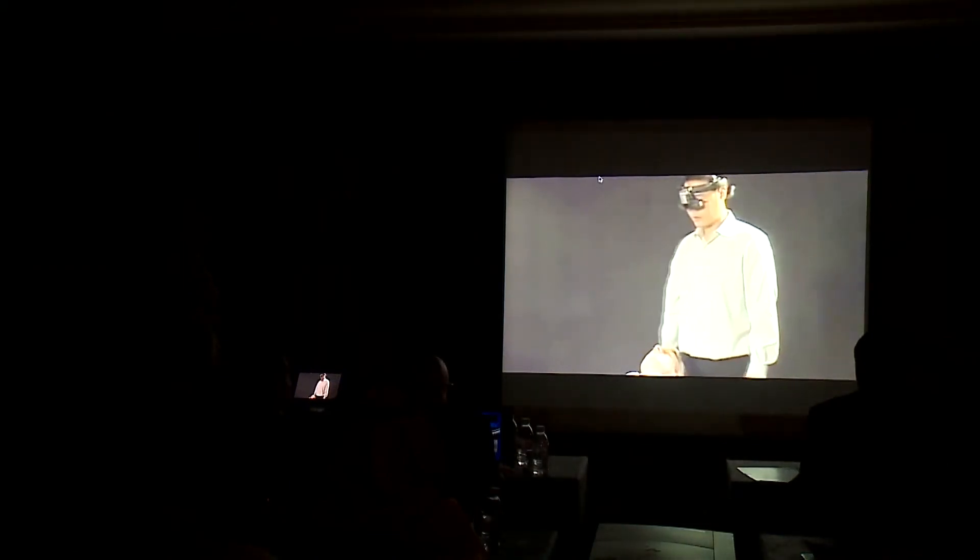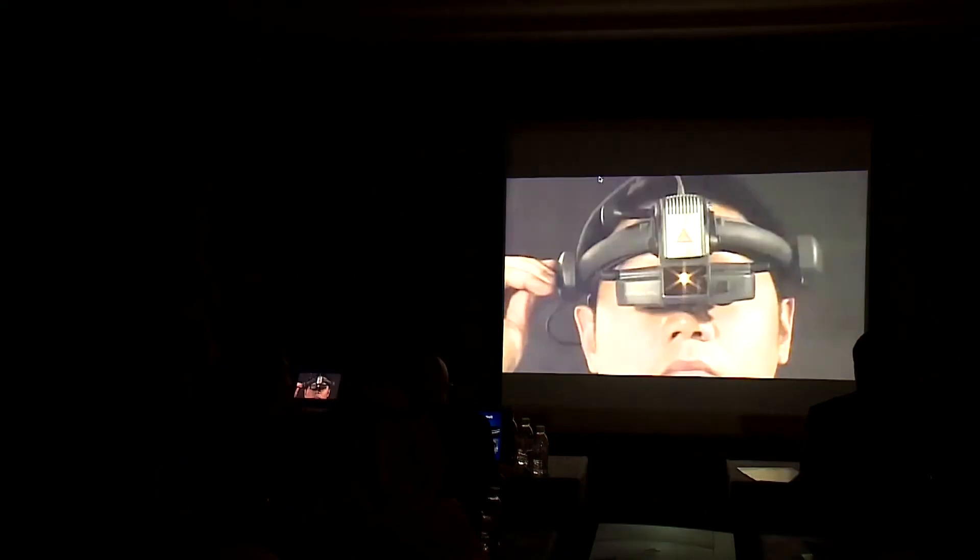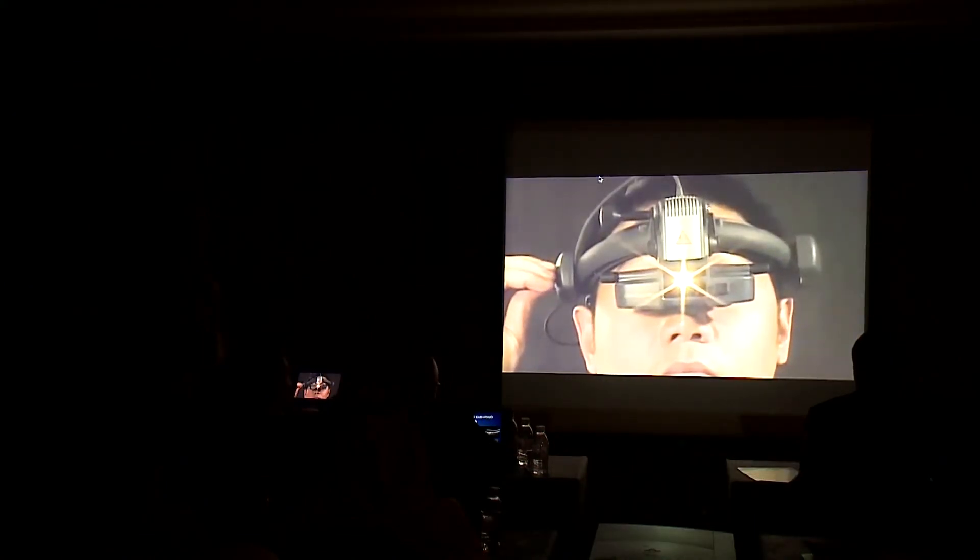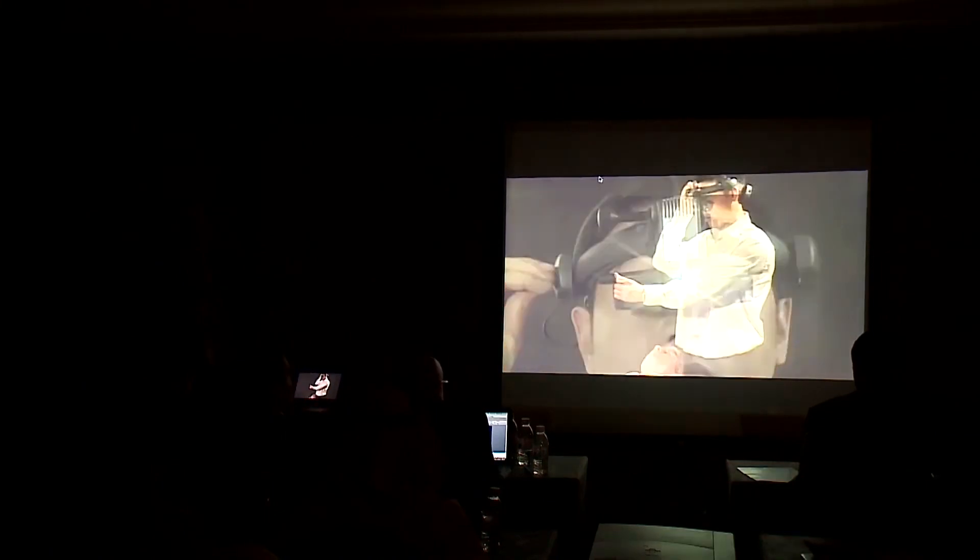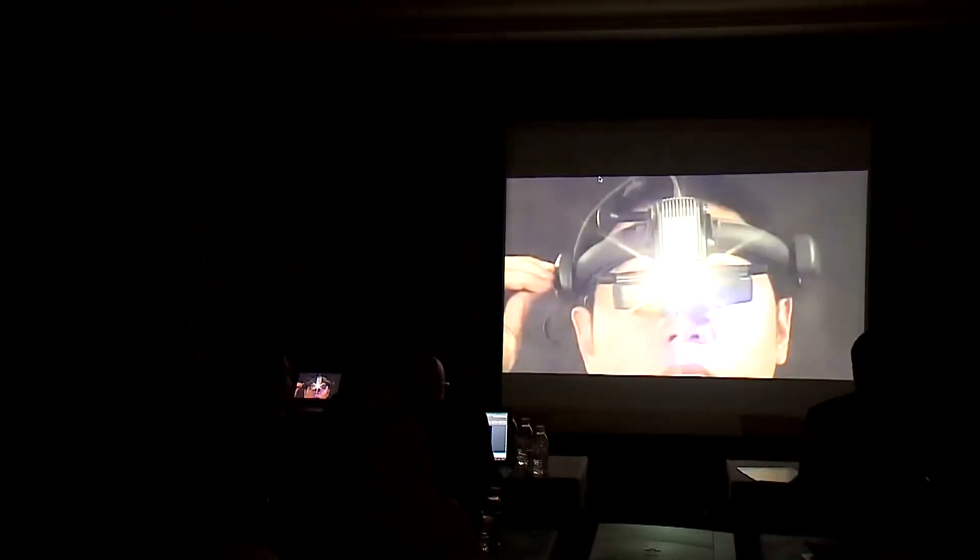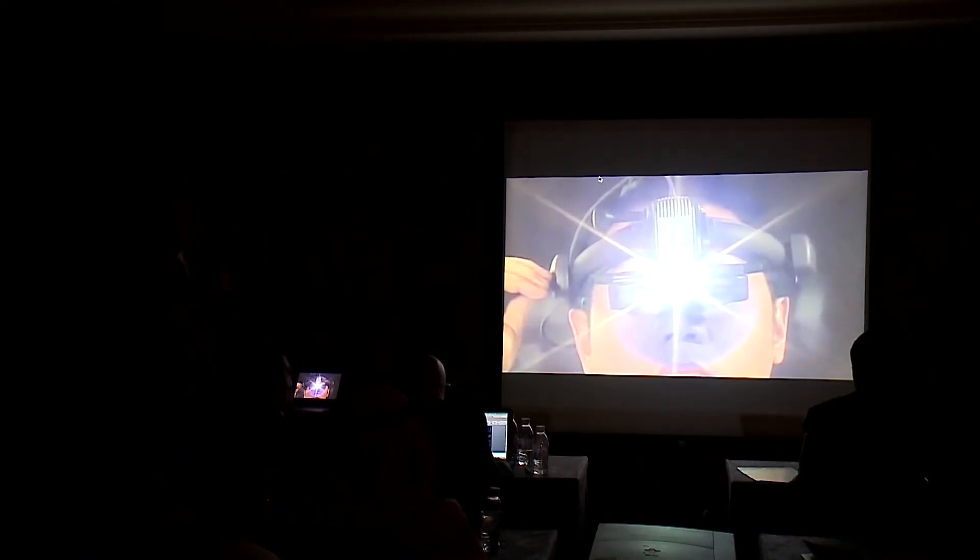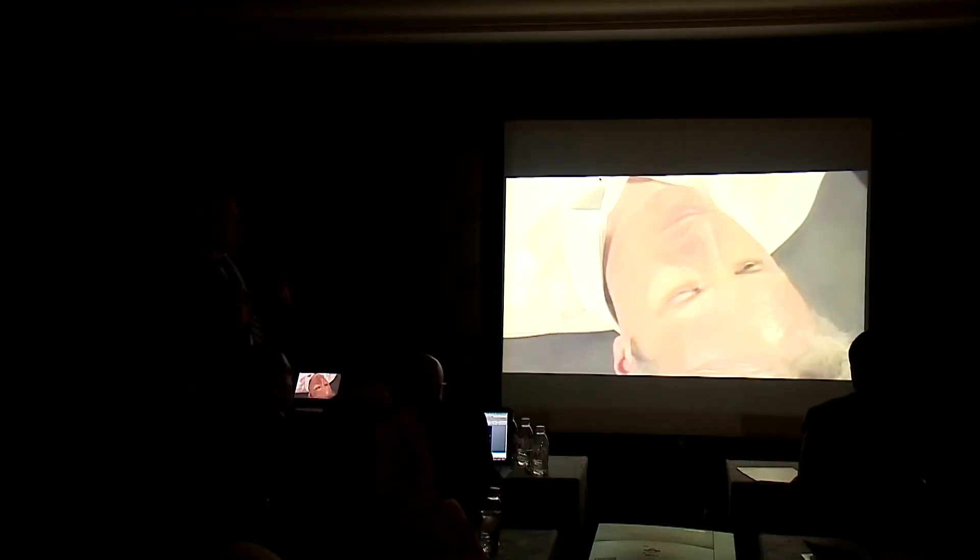This is the start of the clinical examination. Patient preparation, fundus examination, and drawing. This is the patient lying just parallel to the table, adjusting the rheostat to get a lower light, not directing the light directly to the macula at the first time, or you are going to lose the cooperation of the patient. The patient should be resting, and he is instructed to open his other eye all the time, not to close it.